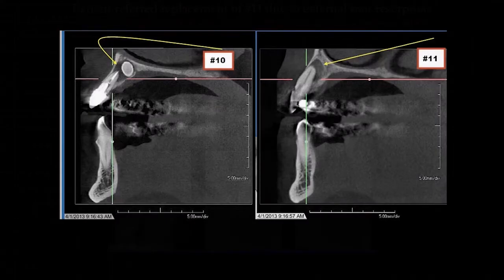The interesting thing is you do a scan, and right above number 10, this huge lesion, you got this going on. So it's like, well, obviously, this thing's got something to do with it. Here's where the resorption is. There's even some of the lesion there.